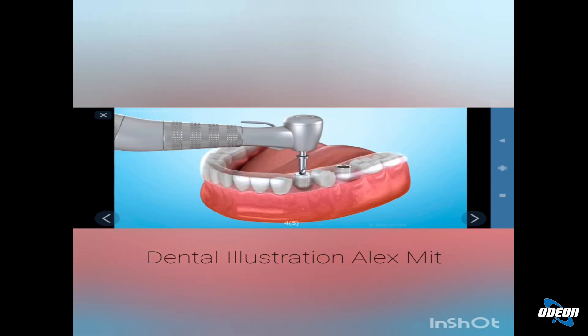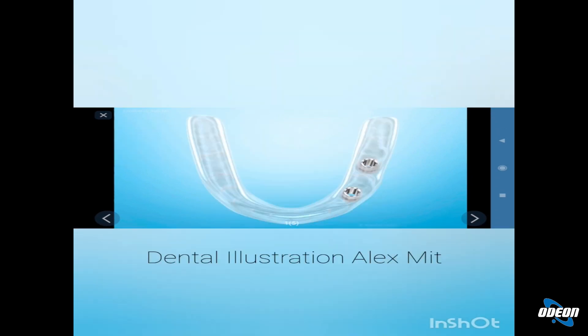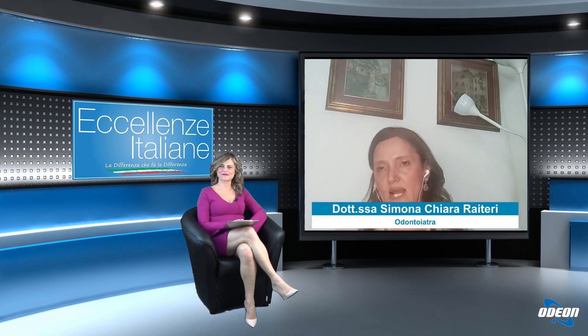Questo piccolo video illustrativo fa vedere che cos'è la mascherina chirurgica. Come si vede è una mascherina trasparente, normalmente trasparente, fatta in una resina specifica, che ha degli appoggi dentali. Si posiziona sui denti, si blocca la mascherina e tramite questi fori, studiati appositamente, si inseriscono gli impianti. Finito l'intervento si toglie la mascherina e gli impianti sono stati posizionati.